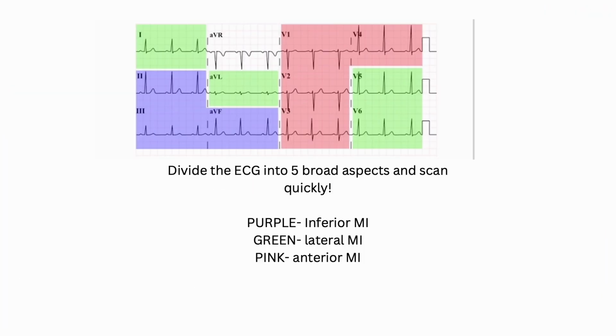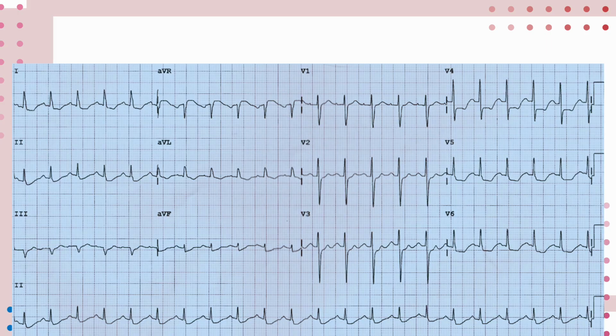I put this together. I did miss the previous slide, but you may be able to rewind that back. Those were pictures showing you what the features of ischemia are. Now, the features of ischemia: T-wave inversion, where the T-wave is in the opposite direction. I'm doing the recording right now, so I may not be able to rewind, but you would be able to go back and look at the pictures. T-wave inversion, pathologic Q waves, ST elevation, ST depression. When there's ST elevation, then you need to look at your patient.